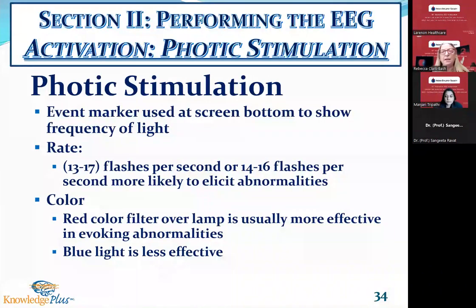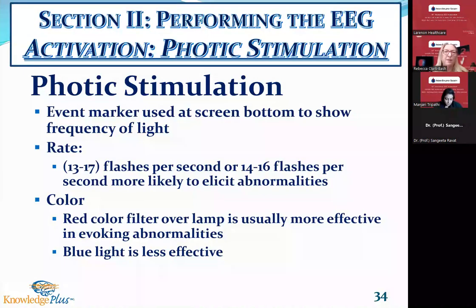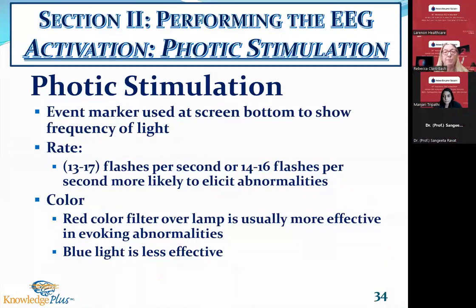Now, decades ago, we had color filters that went over the top of the photic light. So there was a red filter and a blue filter. So after we got done doing photic stimulation with the white flashing light, then we would put the red filter over. And again, that would be more apt to elicit an epileptiform abnormality. Blue light was less effective.